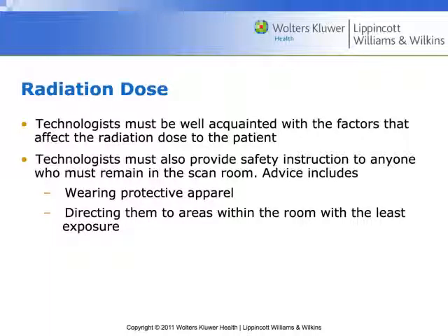Radiation dose. We can use phantoms to measure what the radiation dose is for different protocols. And this is the most typical way that we measure radiation dose for protocols: we take a phantom that simulates, for example, the chest or the head in terms of its thickness, and then within that phantom we will place a pencil ion chamber, right? And we will measure at that ion chamber what the dose is at the center of that phantom during scanning.